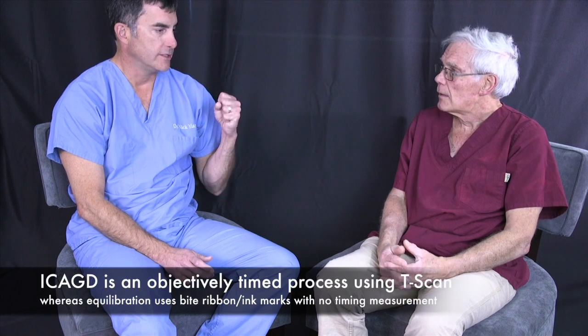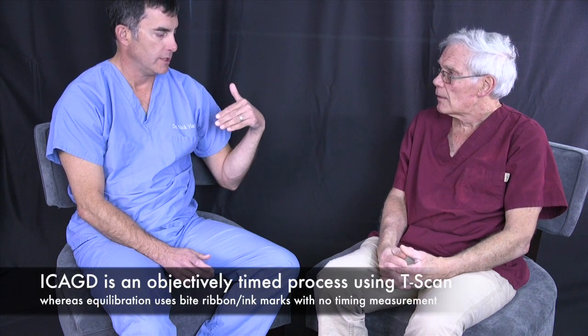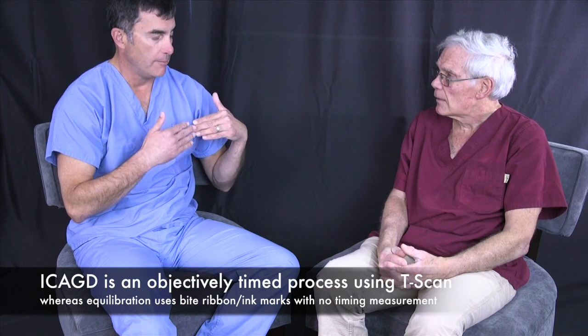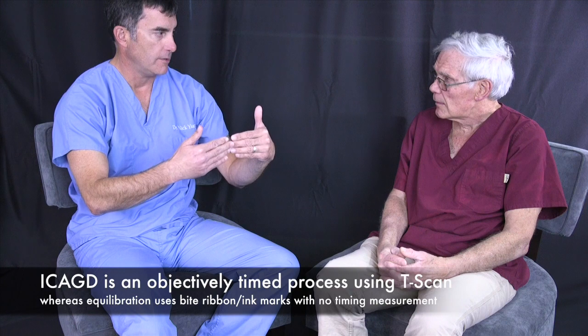Molar contact during excursion, but you see it's unmeasured. The protocols can't measure that. So I can tell you definitively, when I do the ICAGD protocol to accomplish DTR on a patient, I'm measuring, and every single time there is more anterior contact, if it's done properly. The center of force icon moves to the anterior, and that's part of the fix.